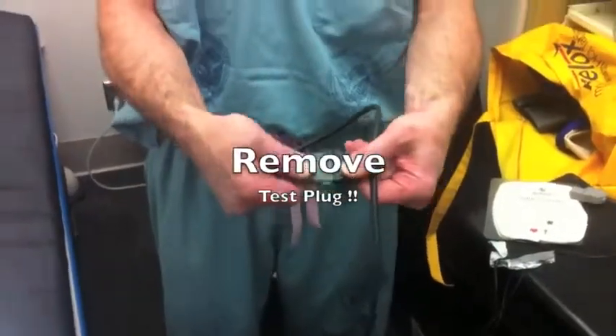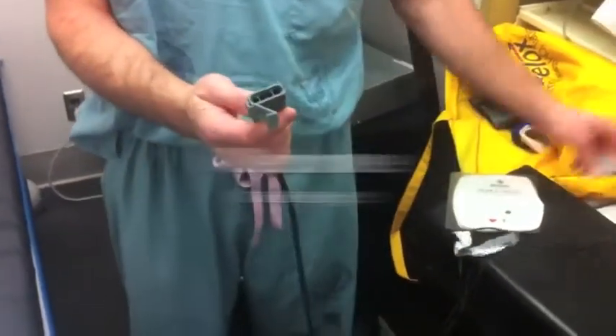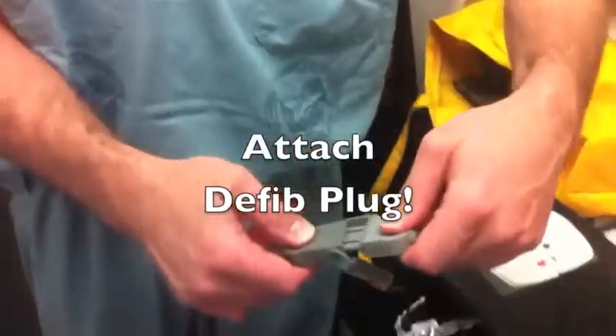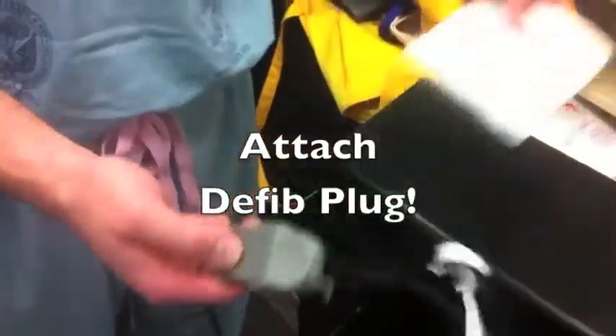Remove the test plug — the test plug comes apart. The defibrillation pads connect to this in one direction; they will only fit in one direction.